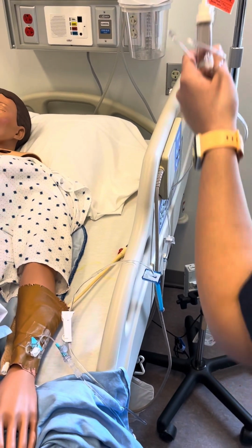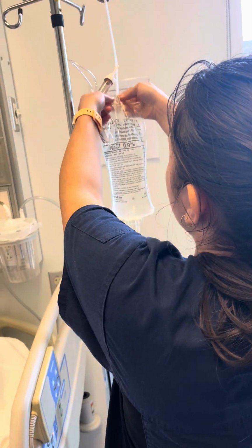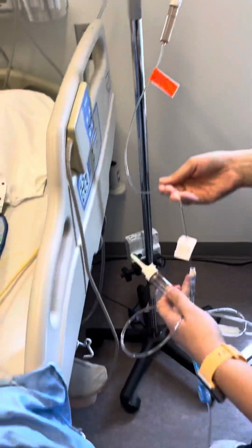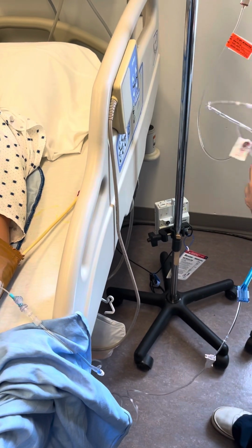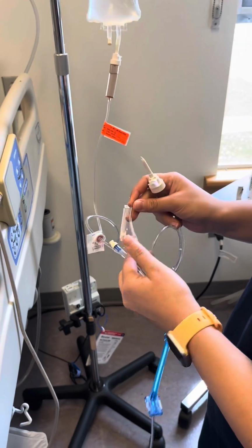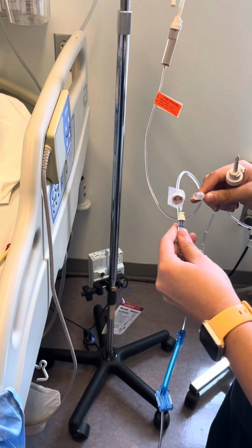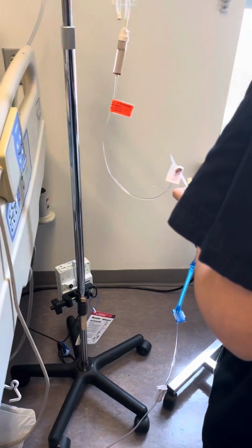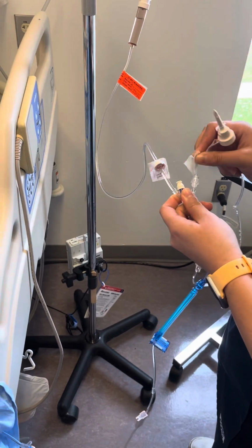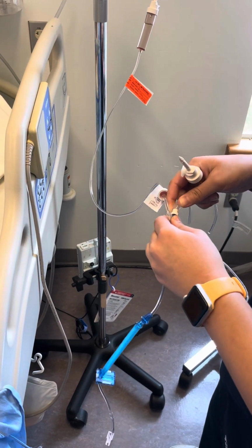I guess what I could do right now is lift this up, put it down lower, because the bag that you want to be administered needs to be higher. So again, looking at this line, like I said before, this would have a cap on it, and this would have a cap on it. There wouldn't be any bubbles. I would check this line, no kinks, no nothing. Alcohol swab this for 30 seconds. Again, it's supposed to have a cap on it. Connect it.